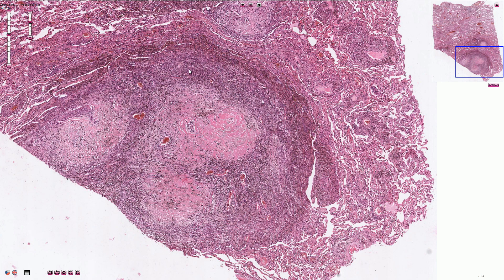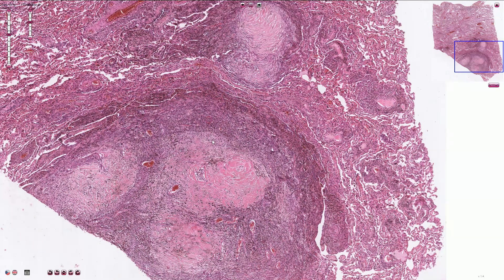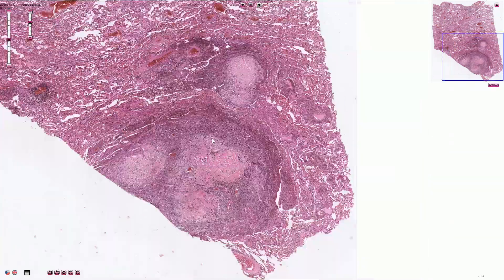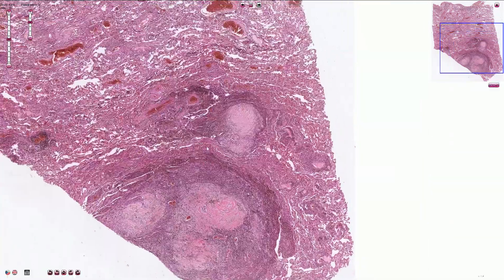Destruction of the capillaries leads to pulmonary hypertension and shortness of breath. When the anthracosis is prominent, we can also call it anthracosilicosis.